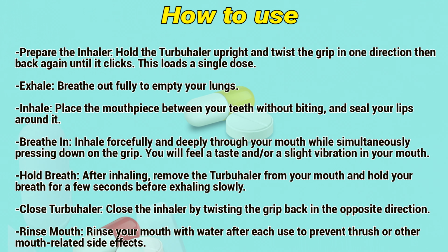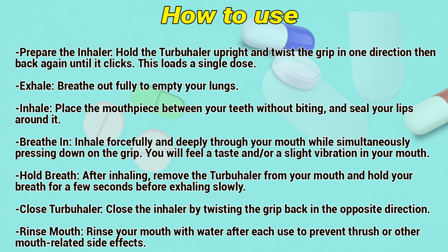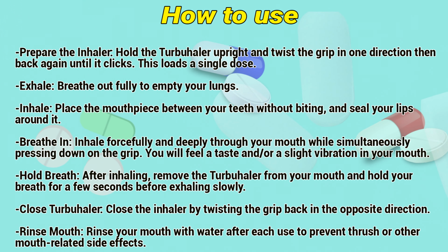Inhale. Place the mouthpiece between your teeth without biting and seal your lips around it. Breathe in forcefully and deeply through your mouth. You may feel a taste and/or a slight vibration in your mouth.